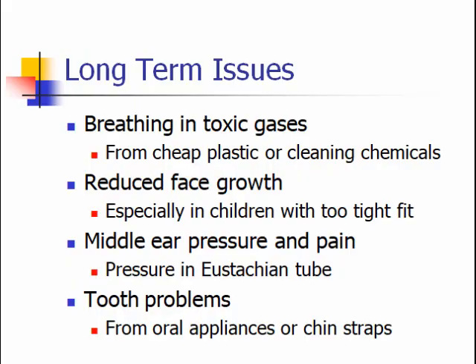There are some long-term issues with CPAP. These don't happen very often, if ever. But one of the things to be concerned about is breathing in gases, toxic gases, that can occur from cheap plastics. If you get equipment off of Temu or Alibaba, that plastic may be cheap and it may release different chemical fumes. Also, if you clean your mask with chemicals, bleach or something else, that residue can be inhaled and give you some toxic gases.